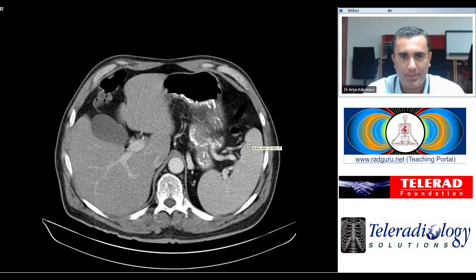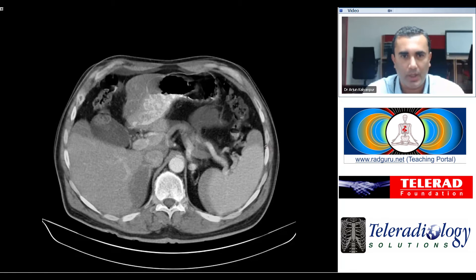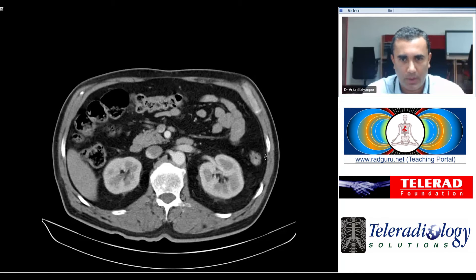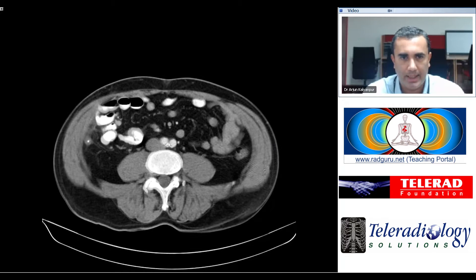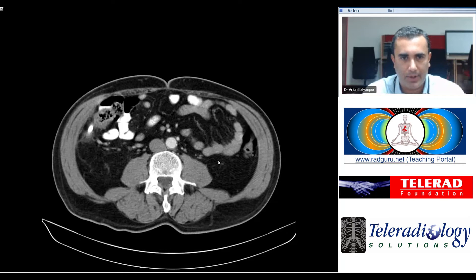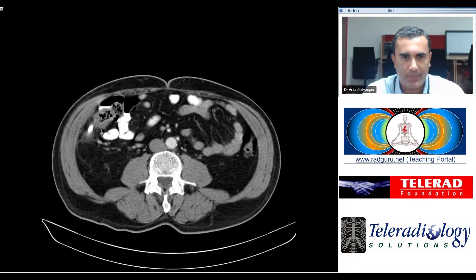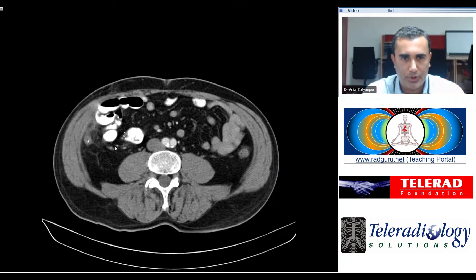An interesting case from the emergency room: a patient presents with right lower quadrant pain. A CT scan of the abdomen and pelvis was performed with oral and intravenous contrast. As we scroll through, we start to see an inflammatory process in the right iliac fossa, actually in the right flank. This is associated with the tip of the cecum, with a dense calcification at the base of the cecum, then a short tubular structure with another calcification at its tip, and a fair amount of fat stranding in the region.